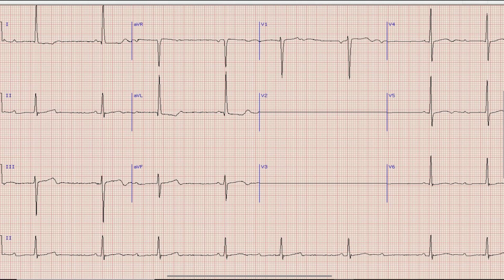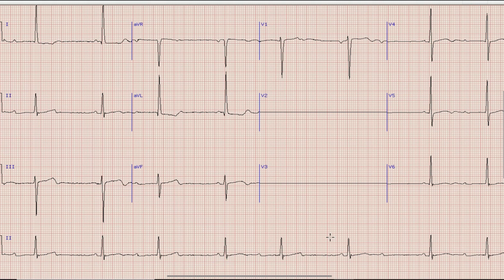As always, the first thing we look at on an ECG is the rhythm. For rhythm we will look at the rhythm strip at the bottom of the ECG. You can see that there are upright and prominent P waves before each QRS complex, which means this is a rhythm originating from the SA node. However, you can also note that the distance between two R waves is not constant — the RR interval is variable.